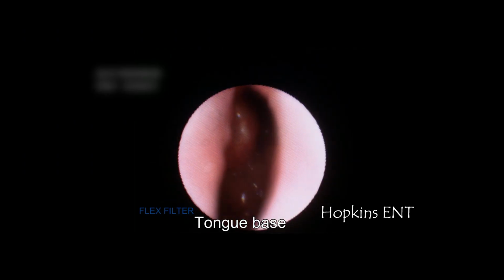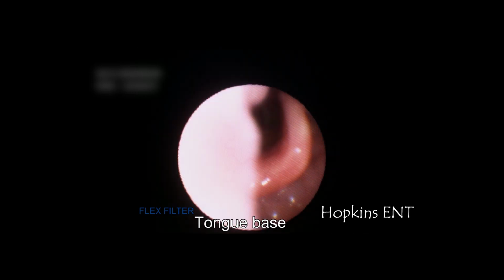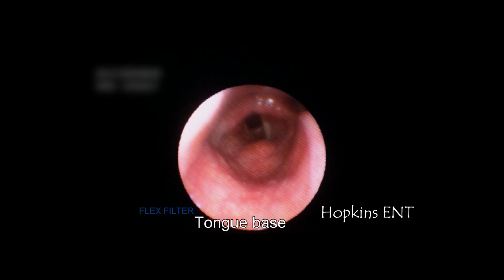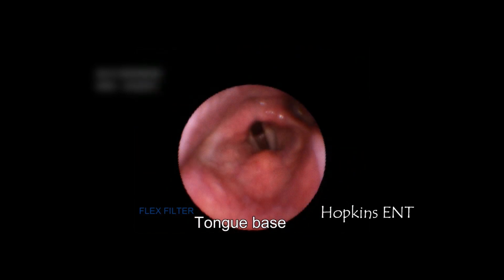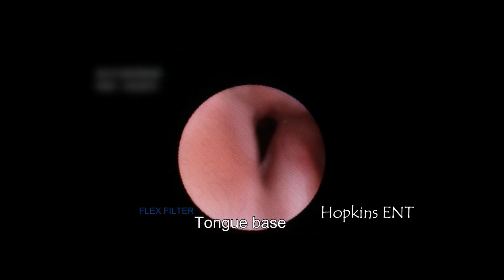And then the fourth video is the elongated infantile type epiglottis. As you can see, the epiglottis is collapsing inwards. It is an elongated infantile epiglottis which is collapsing in the lateral dimension, or it is folding like a door. So this is an elongated epiglottis closing on itself.